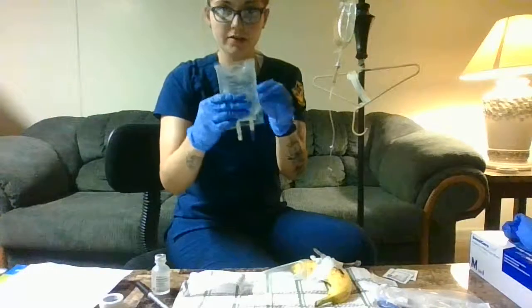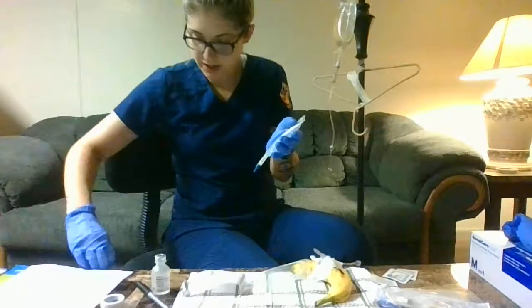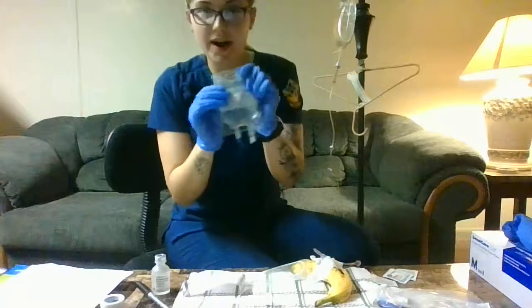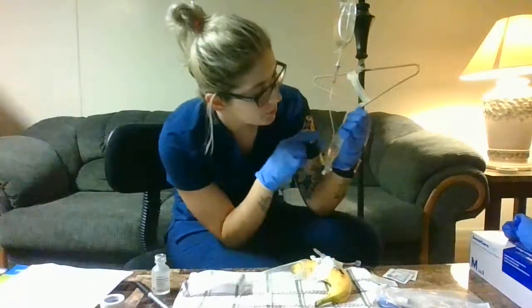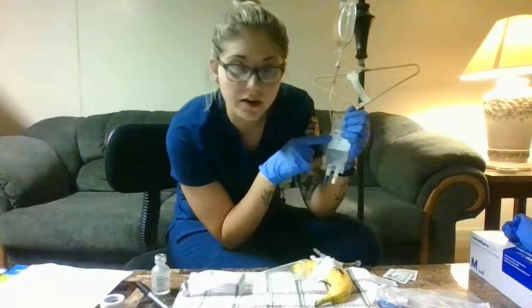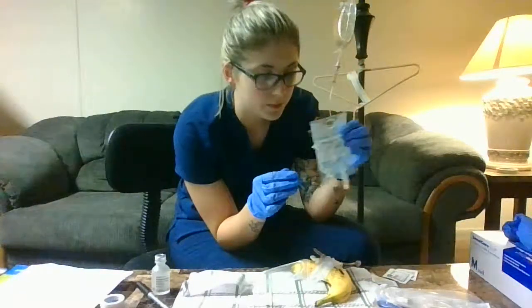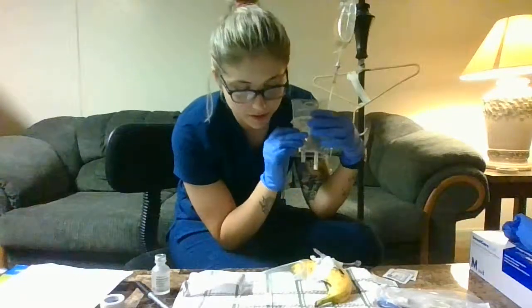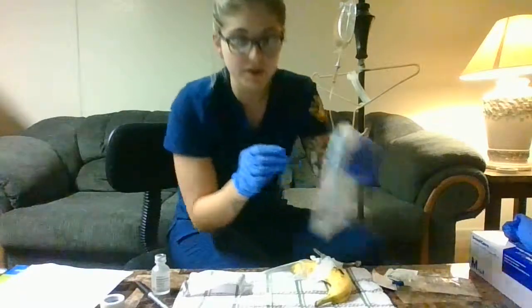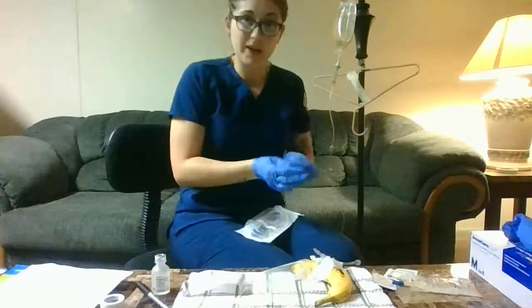Okay. And then you have this here. You're going to label it with a medication label. You can put it on the back, that way it doesn't block the top of this. But you're gonna write the medication that you put in there, the dose that you put in there, the time, date, your initials, and an expiration date. And so then this is prepared and ready. Set that there. So then we are ready to open up our package here.